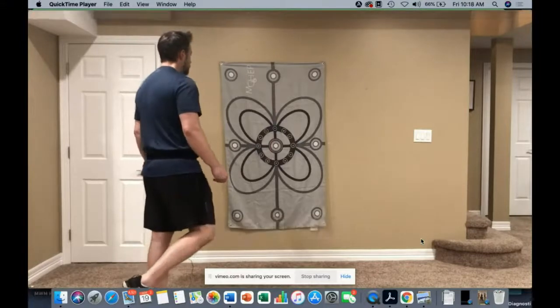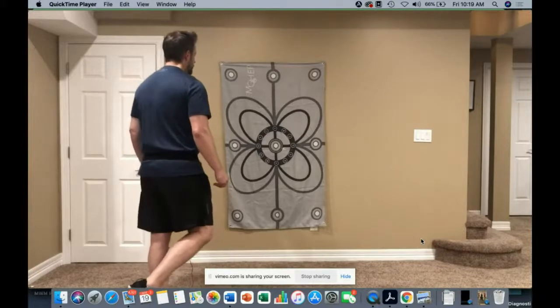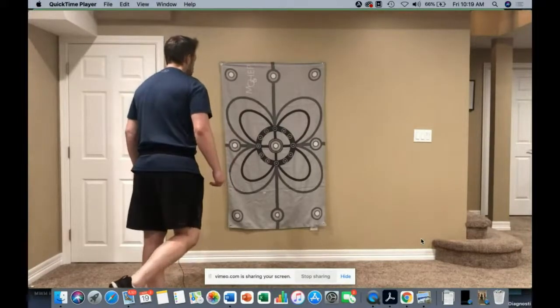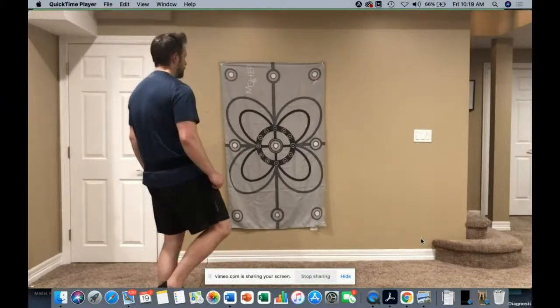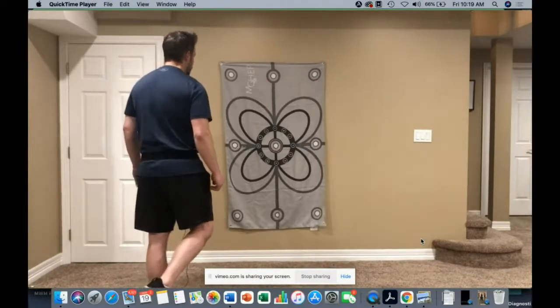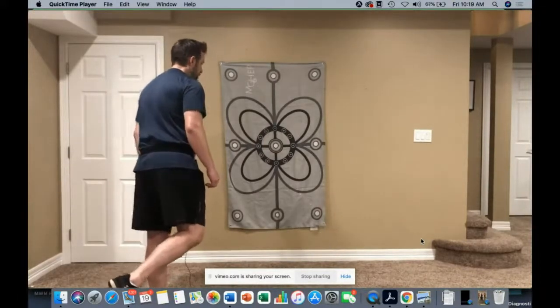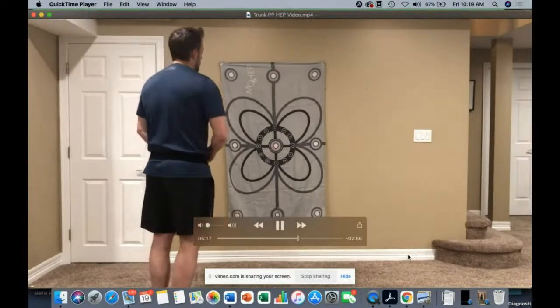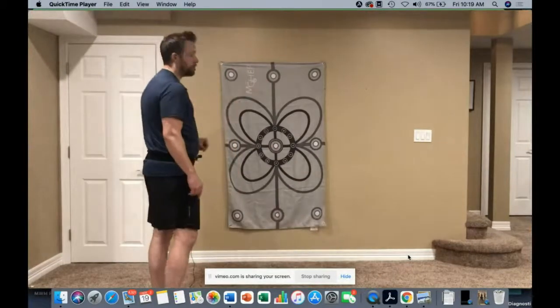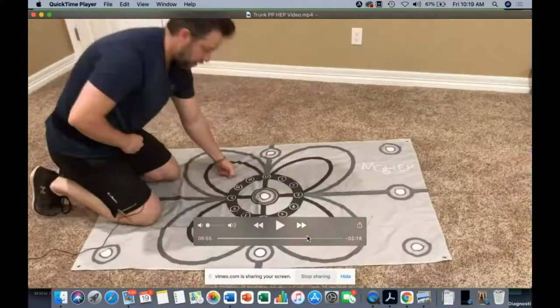So going through a pelvic tilt, going through hip range of motion there, and then combining those types of things, right? So getting more dynamic with your balance applications. Can you even force them to really go through large excursion movements like you saw there? And of course, you could do some cognitive overlay with these things as well. This can definitely promote some more advanced applications orthopedically, as well as you have a person who maybe has an ankle sprain and they're recovering. That could be a fun one to go through as well.